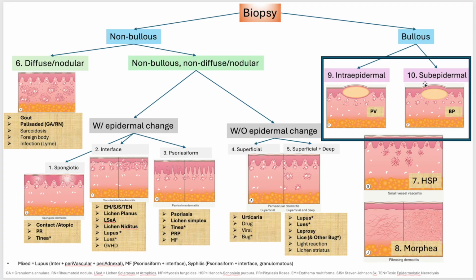And while blistering disorders are not something you sign out every day, understanding the histological split and correlating it with the clinical presentation can really sharpen your diagnostic confidence.